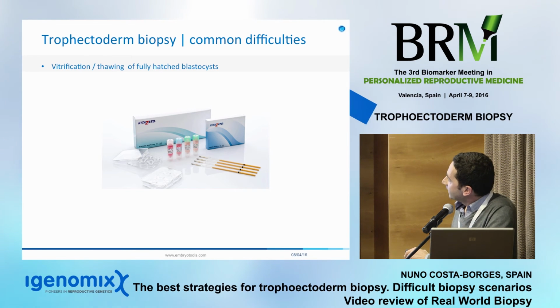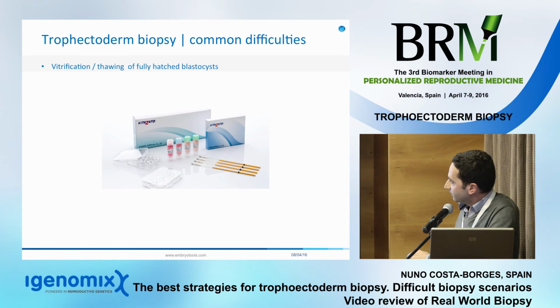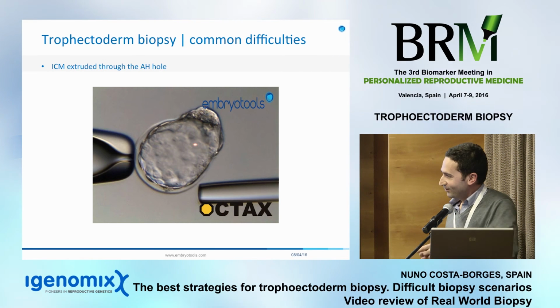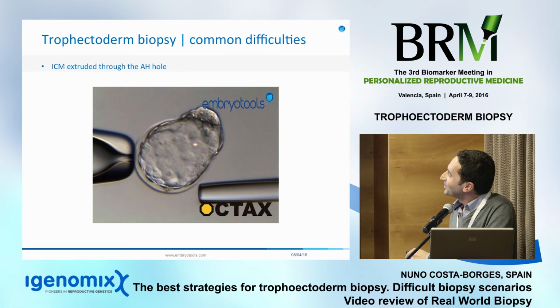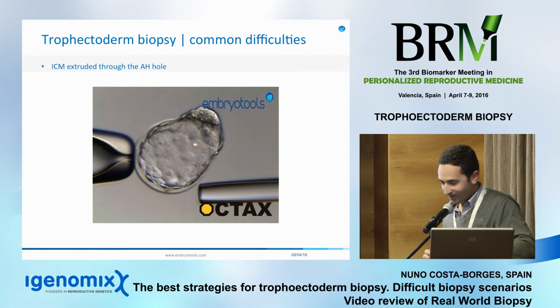Of course, the Kitasato, small volume, open system. But you can also use a closed system that's already ready in the market. And this is the last video. That is the typical case where we did assisted hatching in the previous days, but we had the bad luck that the embryo came out through the inner cell mass, and then we were getting stressed because, how can I do this? So I'll show you the video.